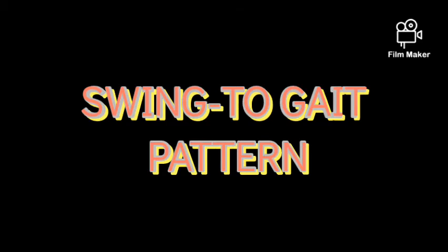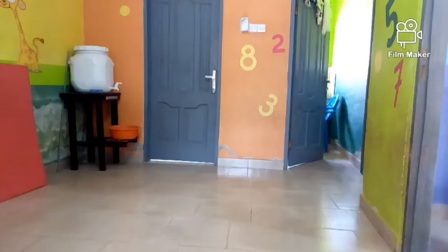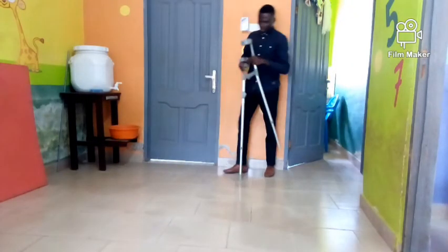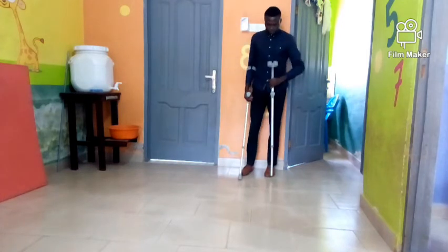This pattern is very fast and the risk of falling is increased. Now let's look at how to demonstrate the swing-to gait pattern with elbow crutches. PT Thomas is going to demonstrate.